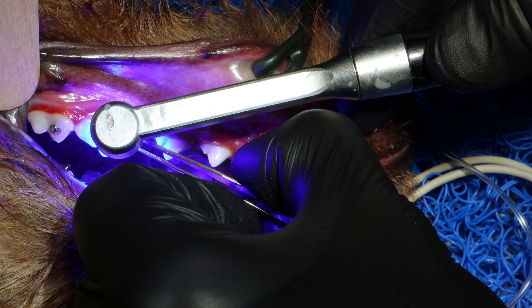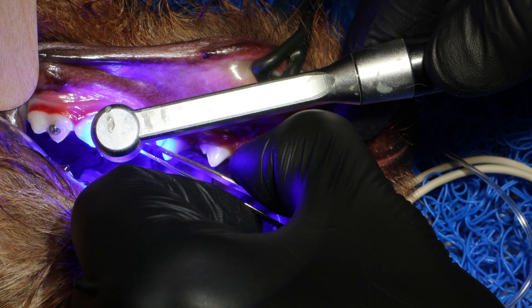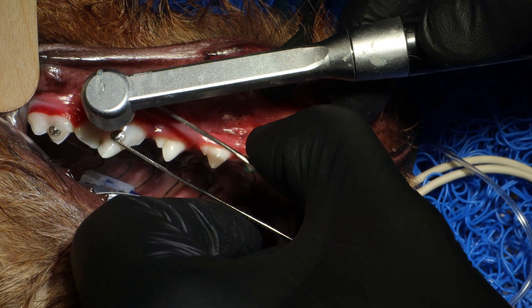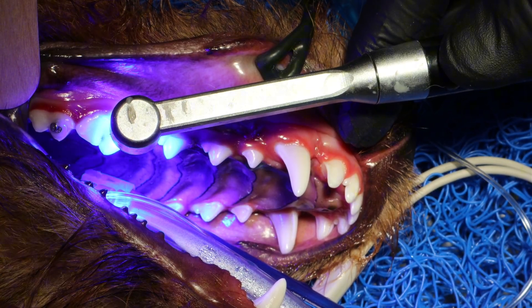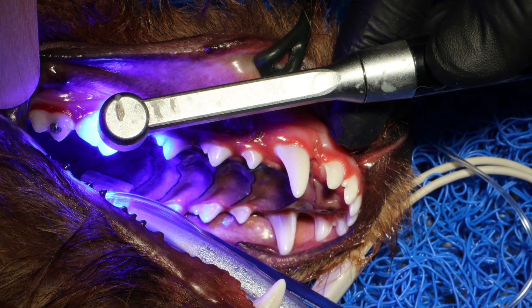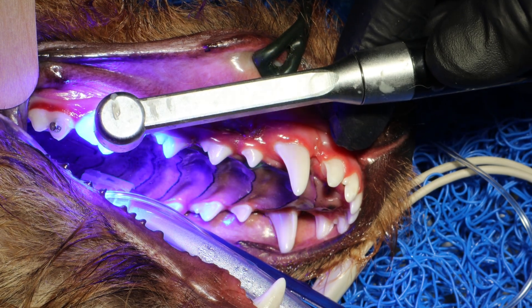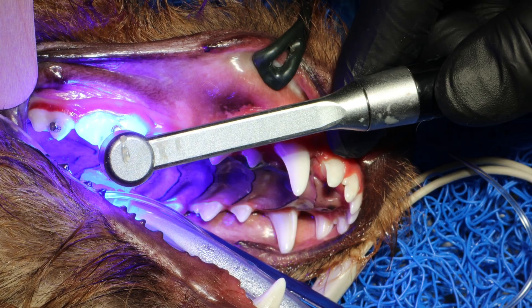Put it on this spot. I'm just touching the button with my light here to kind of press it towards the tooth a little bit, then release with my forceps and cure it a little bit longer. Be aware that curing guns can produce quite a lot of heat, so you want to keep a little distance from the tooth but not too far away, because it can actually heat up the tooth causing pulpitis and pulp issues. So make sure you know how hot it gets.